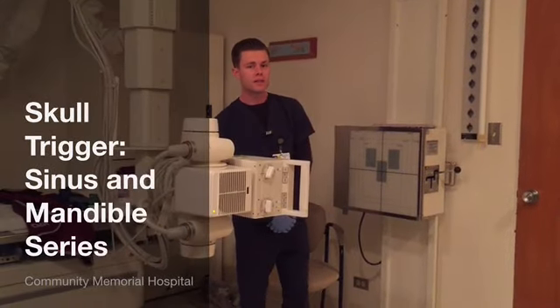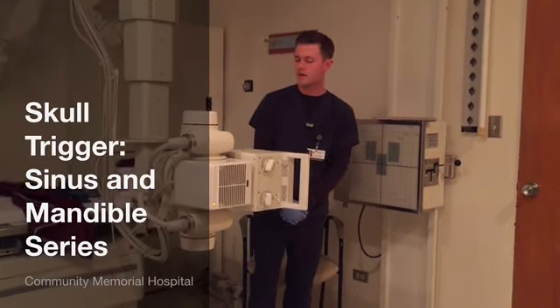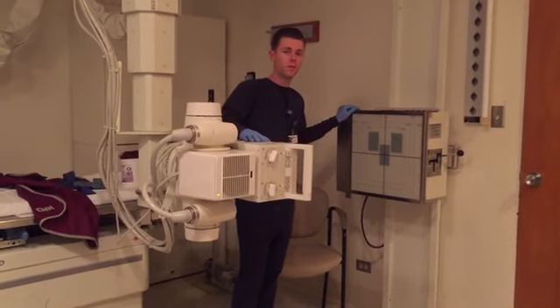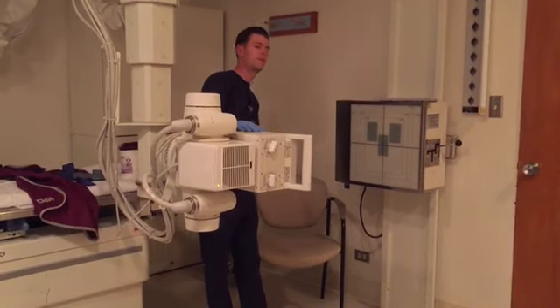My name is Cameron, and today I'm going to be demonstrating how to perform a sinus and mandible series. I've got my tube here directed to the wall bucky. It's going to be a 40-inch SID. We're going to be using the upright bucky. I've got a chair here ready for my patient.